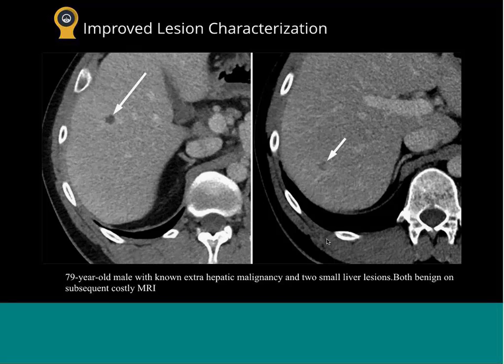Because if they're met, you change the treatment. The patient has to get chemoradiation. I've got to go to surgery. So you get an MR. So they had to wait, delayed the surgery, patient anxiety, got an expensive MR. These were benign. Okay? That's not a fault of ours.